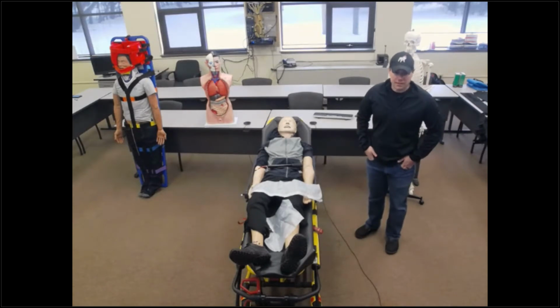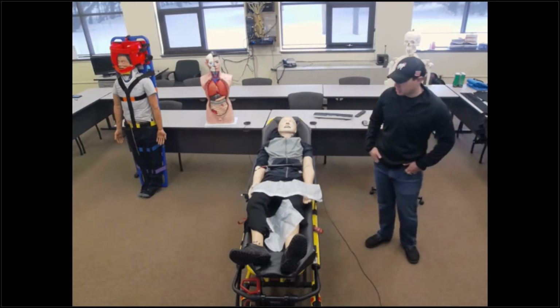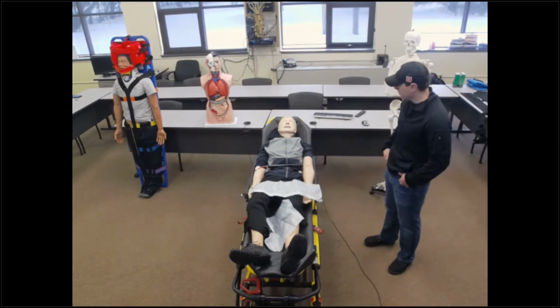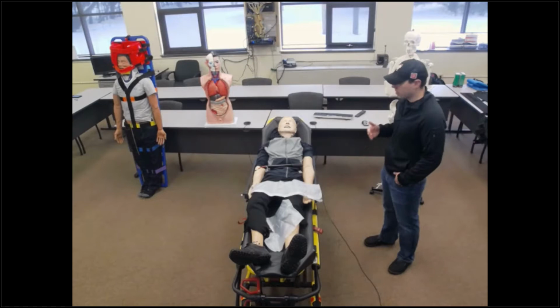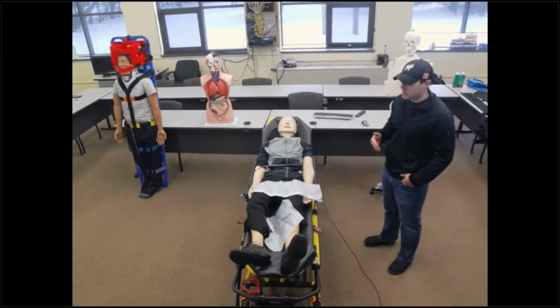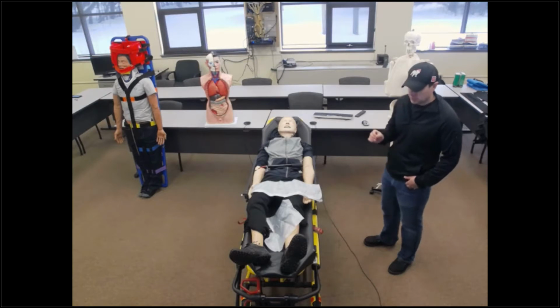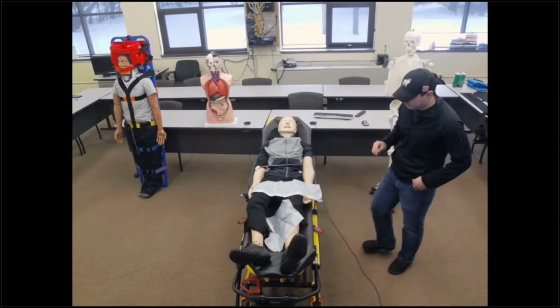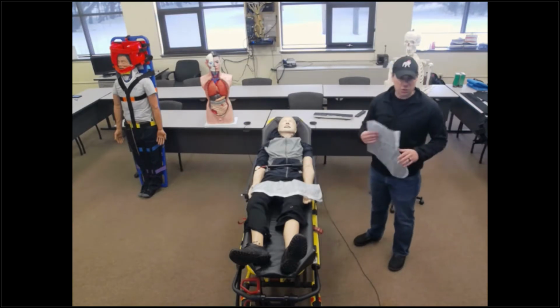Welcome in, everybody. So we're going to be discussing air splints in this specific segment, talking about proper application and then indications and contraindications. So first, indications, we have a musculoskeletal injury to one of the extremities. This is where we're going to be utilizing air splints or other type of splints. But for this segment specifically, we're talking about air splints. So if you haven't done so, please watch the introduction to splints prior to watching this.